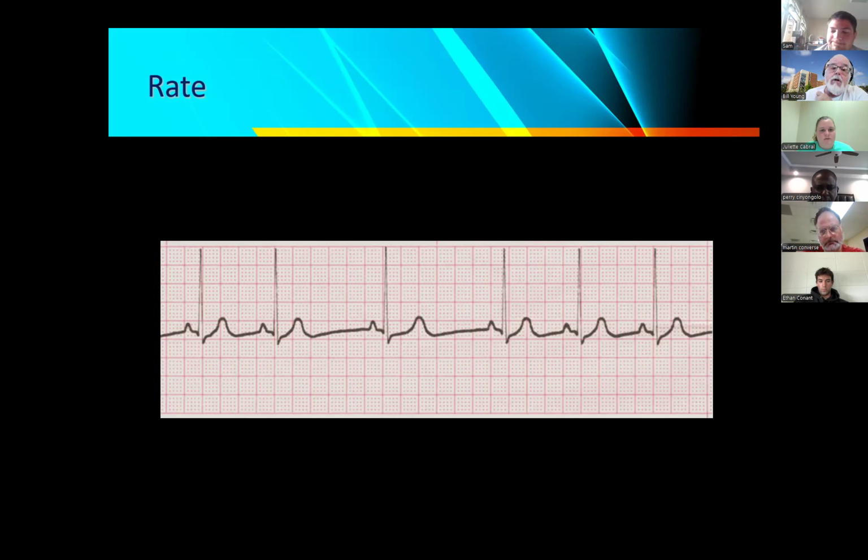Yes. Very good. Very good. So, yes, I would agree with you as well. It looks like there's just 2 beats that are missing there after the second beat, and then after the third beat that's shown, it looks like it's missing 2 beats. Ah, okay. So now this is going to be important because remember, we have 3 types of rhythms that we've learned that are sinus rhythms that can sometimes look like that they're missing one or more beats. So here's the thing we got to do.